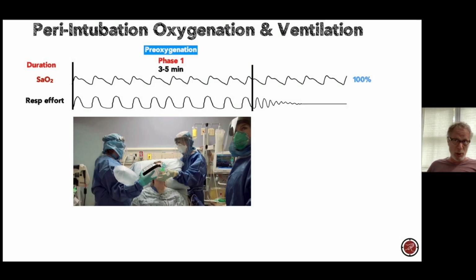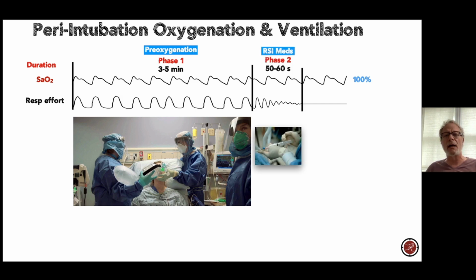The biggest and most important segment that's going to prevent or decrease the chance of having desaturation during laryngoscopy is what you do before you give drugs, right? It's not really all dependent on those nasal prongs that we have on during laryngoscopy. It's what happens in this period, that 3 to 5 minute period, that phase 1 that we've already talked about. So max that out in that scenario.